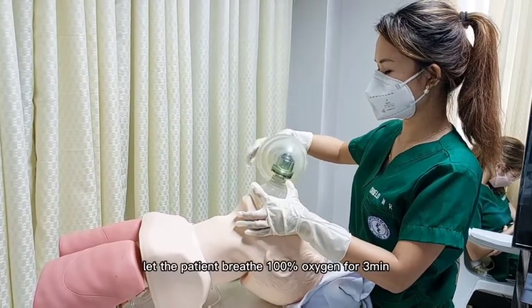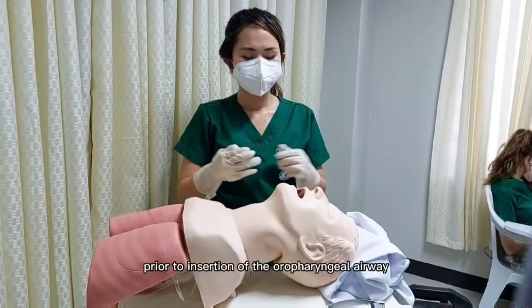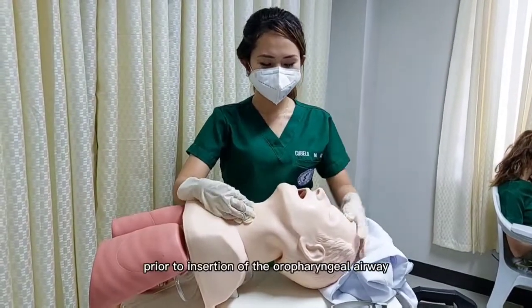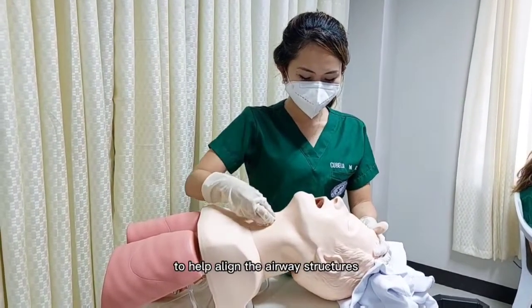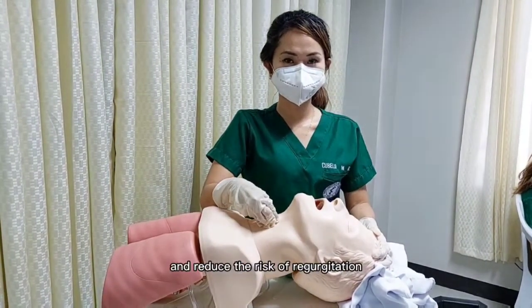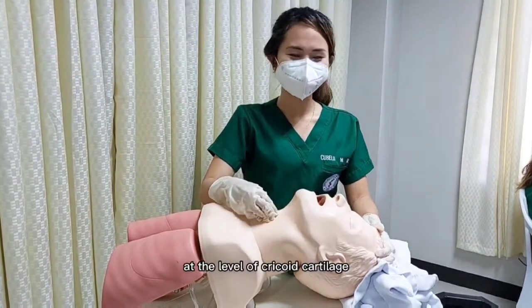Let the patient breathe 100% oxygen for 3 minutes. Prior to insertion of the oropharyngeal airway, the Sellick maneuver is performed to help align the airway structures and reduce the risk of regurgitation. This is done by applying a gentle pressure at the level of cricoid cartilage.